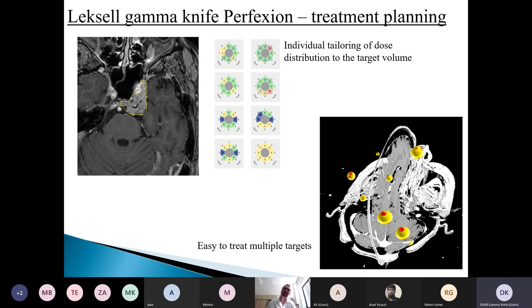It's rather a question of what each department accepts. For example, we are relatively strict about the number of metastases, which we take as the total number of mets which a patient has. Typically, we try not to treat patients with more than 5. We actually did treat a couple of patients with a higher number, but generally it's not our approach.